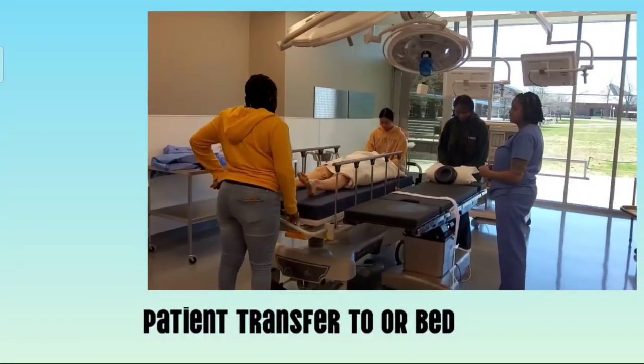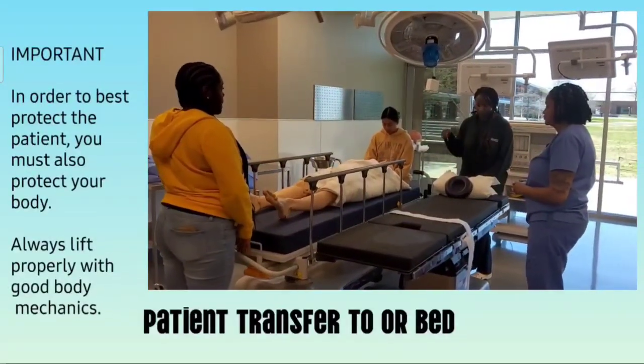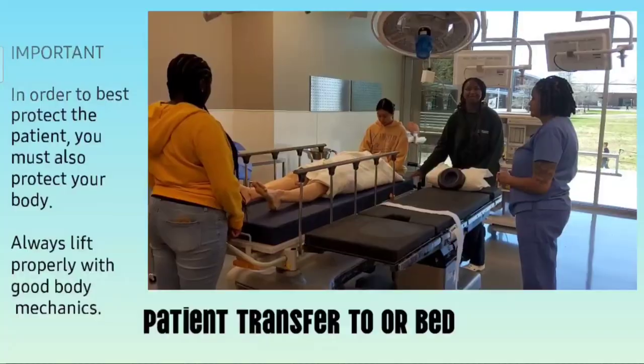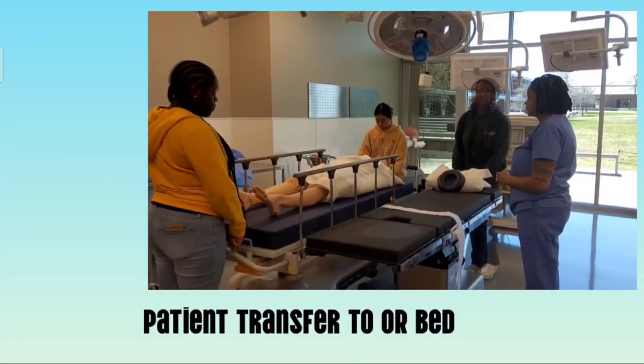Safety precautions we must follow is to always use the right amount of people while moving the patient, use good body mechanics, and apply a safety strap after putting the patient on the OR bed.